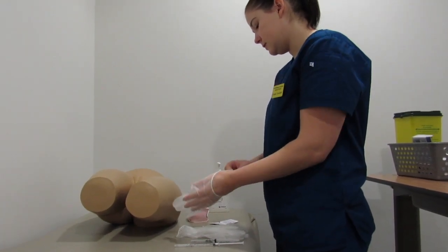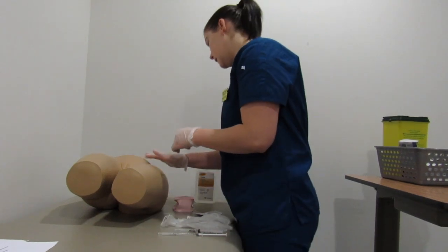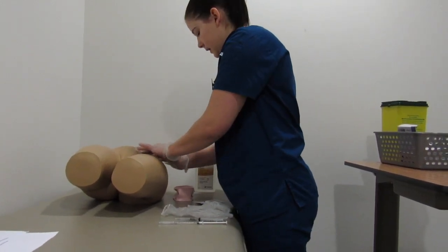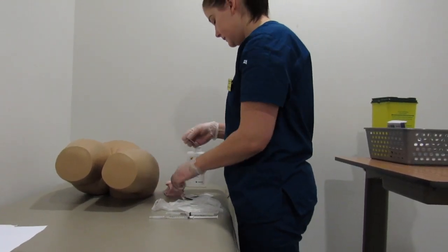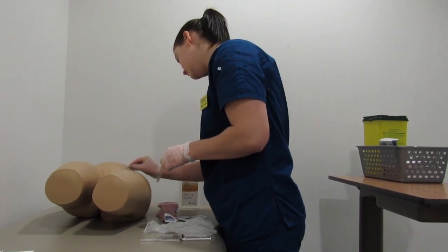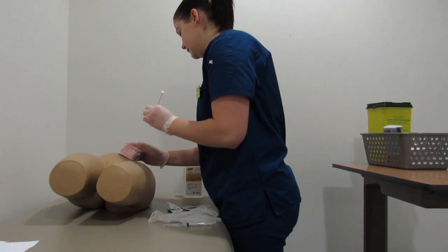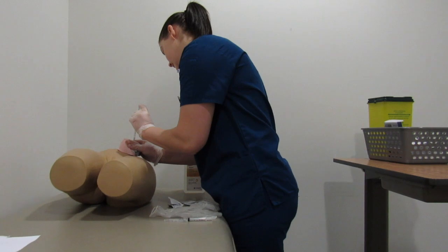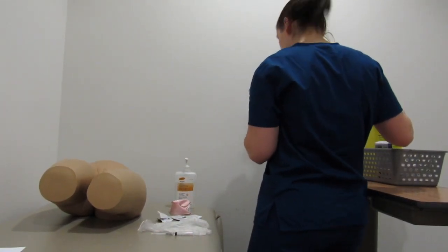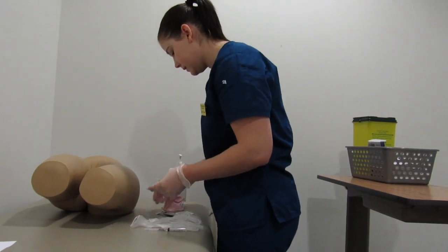So Mr. Mancini, do you have a preference on which side I put the shot on, either your left or your right? No? Okay. Now I'm just going to palpate around the area, and if you feel any pain or tenderness, just let me know. Nothing? Okay. Now I'm just going to swab the area to clean the site. All right, you're just going to feel a slight pinch. We're all done. I'm just going to discard the needle in the sharps container, and I'm just going to give that one last wipe. And there's no bleeding or anything like that, so that's good.